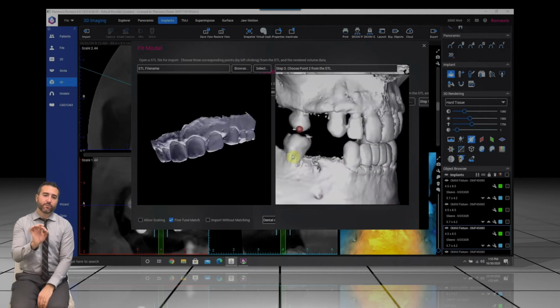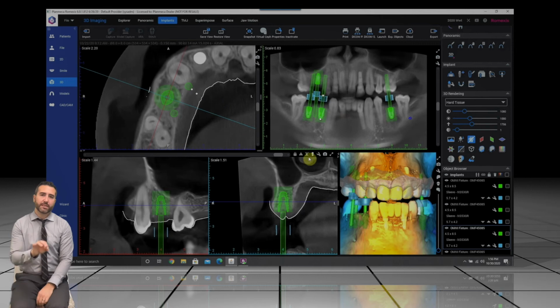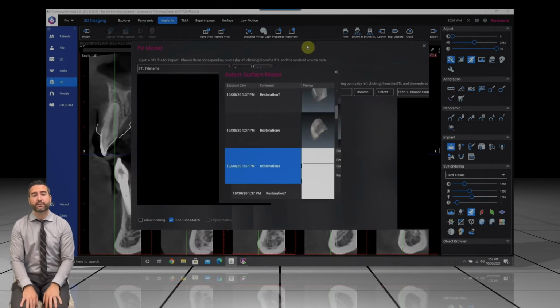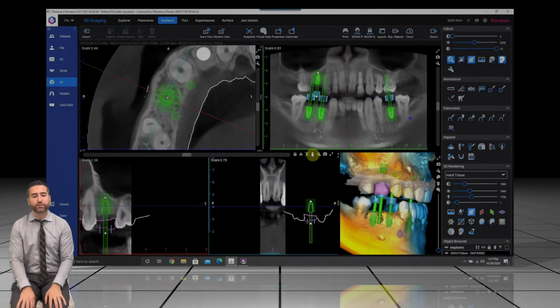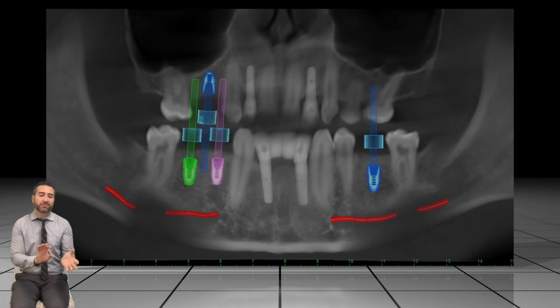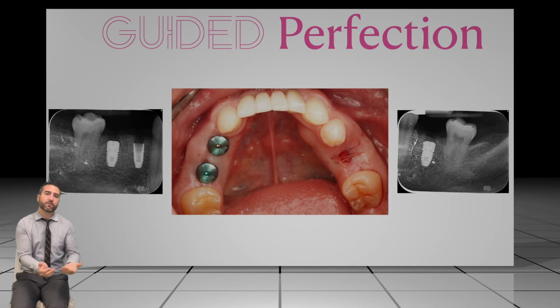Now what's even more impressive to the patient is I'm able to bring in that wax up that we just did and pin it to the CBCT in 3 dimensions. So here we are bringing in the diagnostic wax up. So we have the teeth in there for a truly restorative driven top-down plan. And I could definitively now say whether we could do screw retained or whether we're going to need custom abutments, angled screw channels. I could understand a little bit more what I'm going to need on the restorative side, which also starts to set the tone for the price as well.